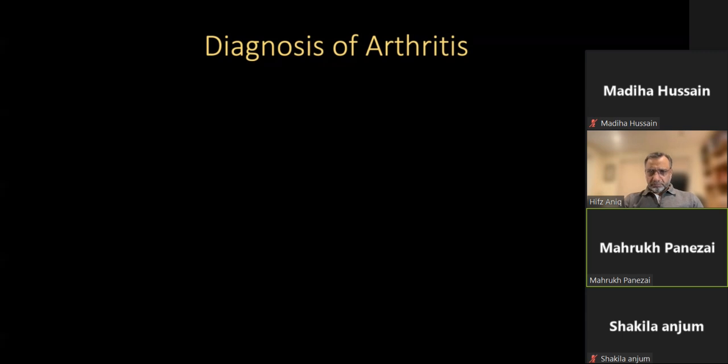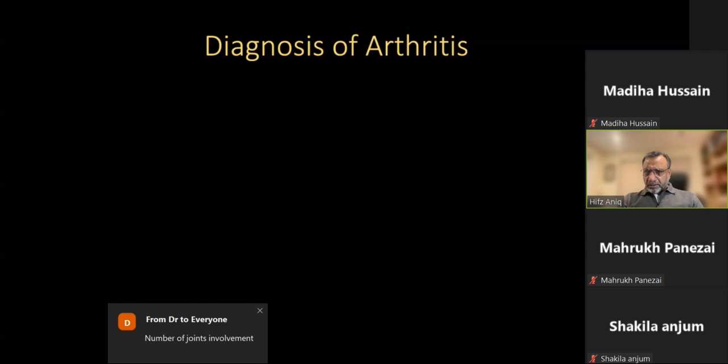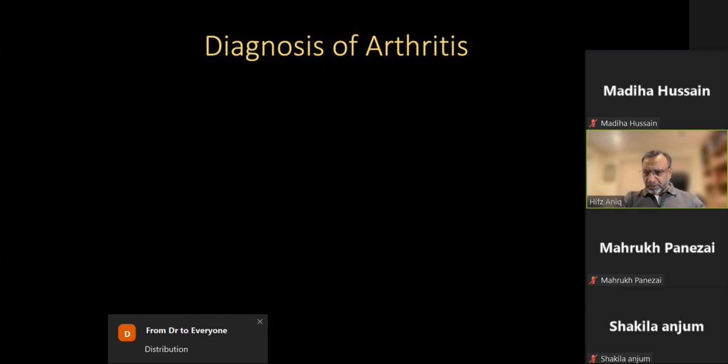Starting from the bone density and then coming to the sites of interest, like the specific sites involved in RA or the specific sites involved in OA, that would be different. So that would be done in that case. Yeah, so right thing. Yeah, number of joint involvement. Yeah, exactly. Distribution you wanted to say. Rheumatoid is particular. Very good. So we just need to see which joints are involved mainly in that condition. That makes our life slightly easier.